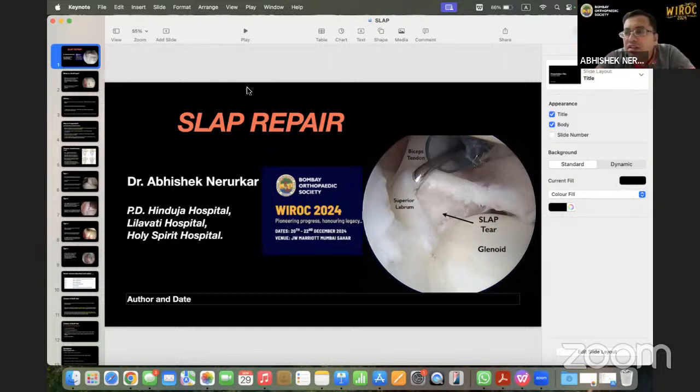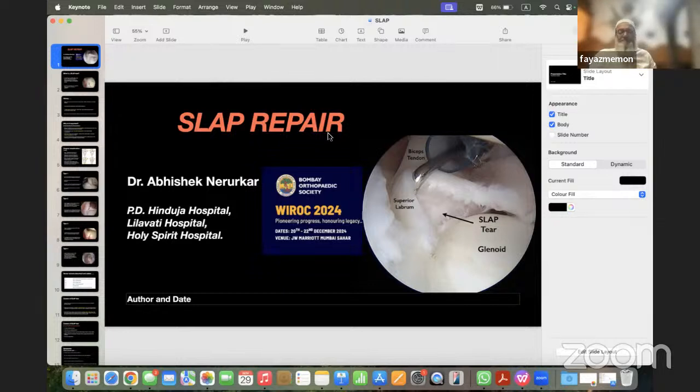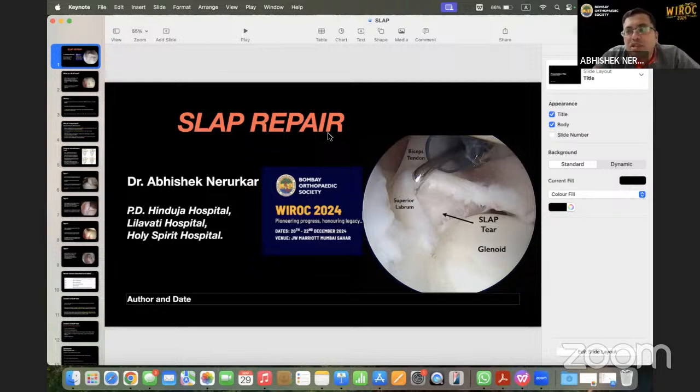If I can make a point regarding this subchondral cyst that Sajir said. Yeah, go ahead, we can listen. Yeah. So basically, the possible explanation for that is the hydrostatic pressure that is there inside the joint. And it is very important that if you are using these anchors, you cannot get away, whatever you do, you may have this cyst formation, but you have to give a good compression, because if your bite is loose or if your labrum is not compressed properly, then the chances are more. So you have to be very careful about using these anchors.